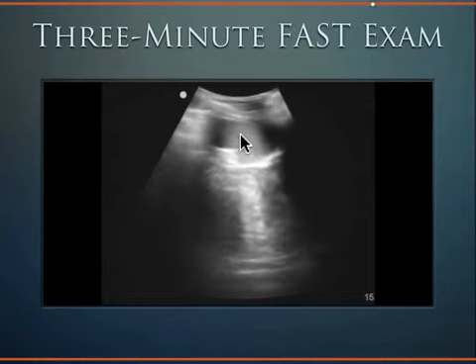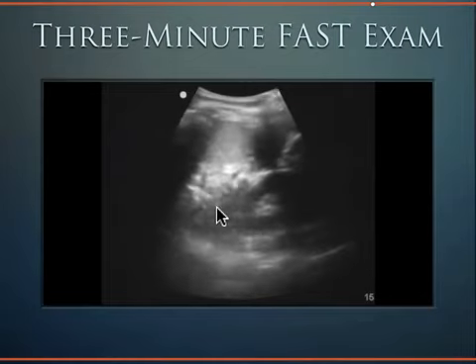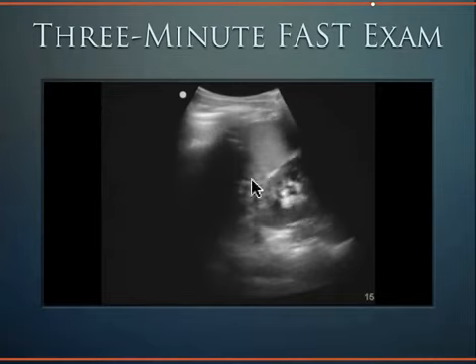Now you may need to fan more posteriorly in order to get this stomach out of the view and to obtain this nice crisp splenorenal view.